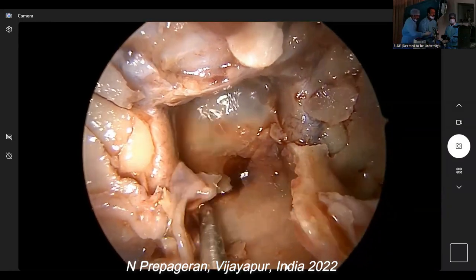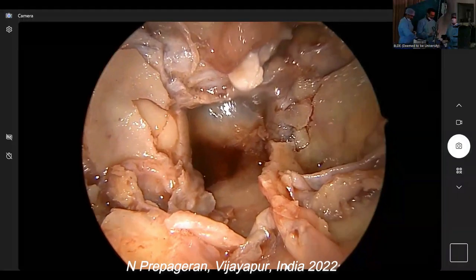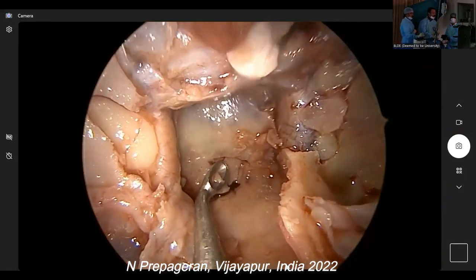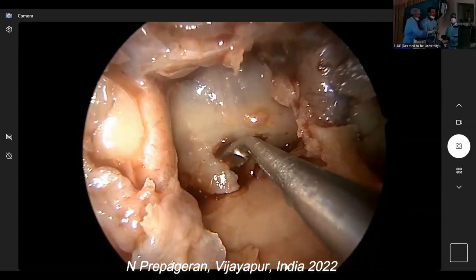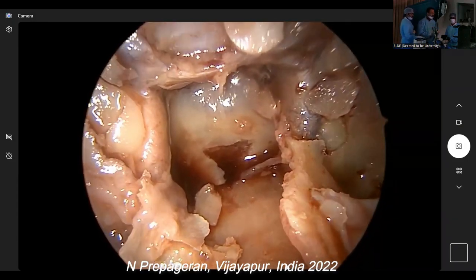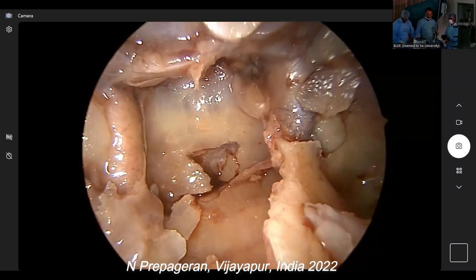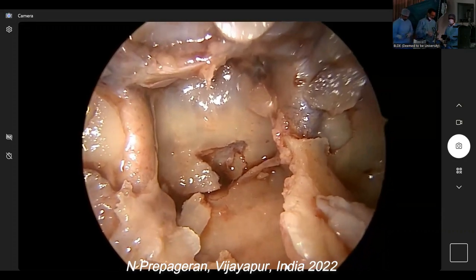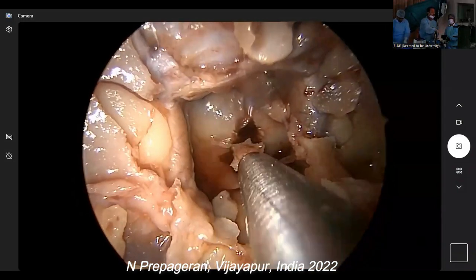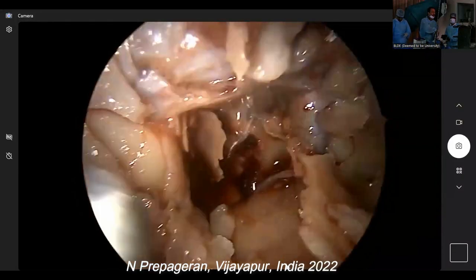Guys, can you see? That's the dura of the clivus at the back. Okay, suction again. I'm going to curette again now. Can you see? This is what I do in real life as well. I just drill. This is your clival plexus. Now I'm going to remove the bone. See, all I need is one small space where the dura is open. Once that is done, I can flick the whole bone.